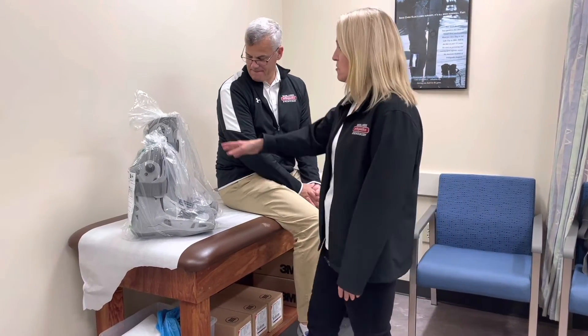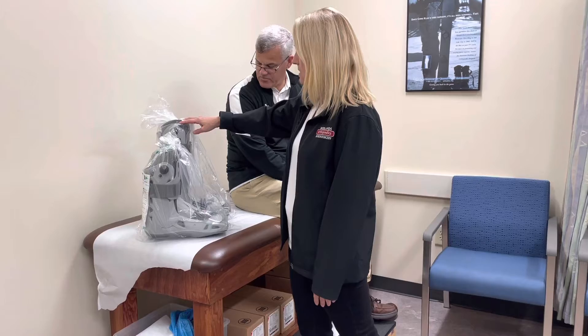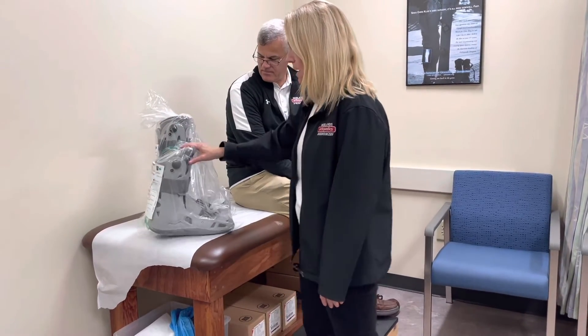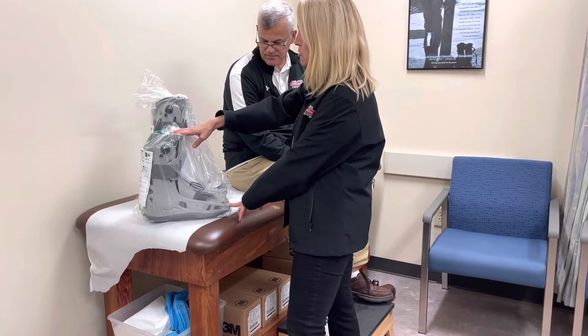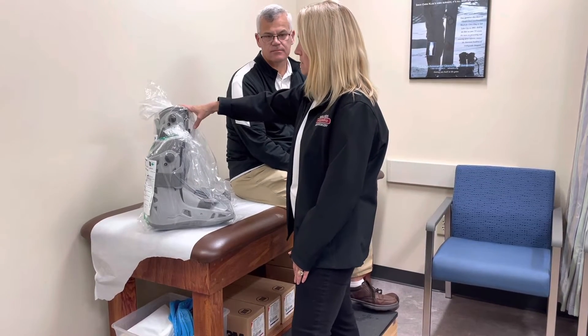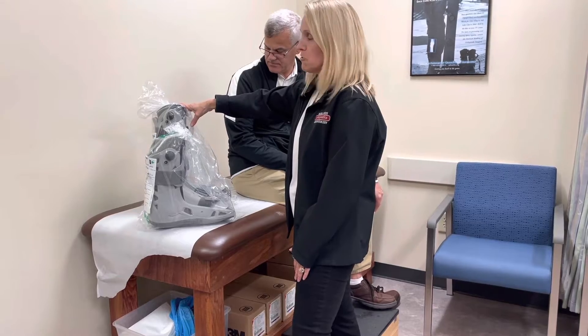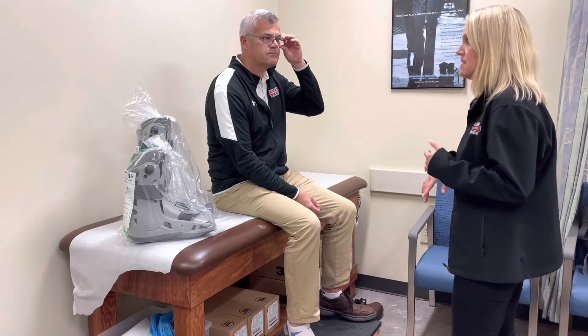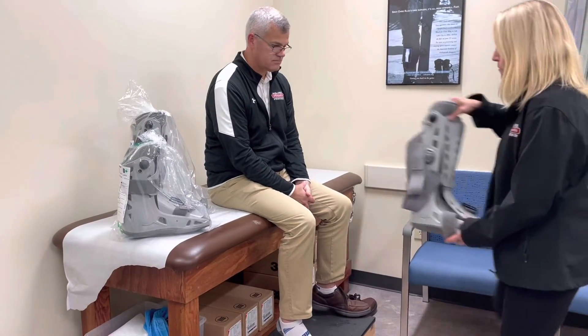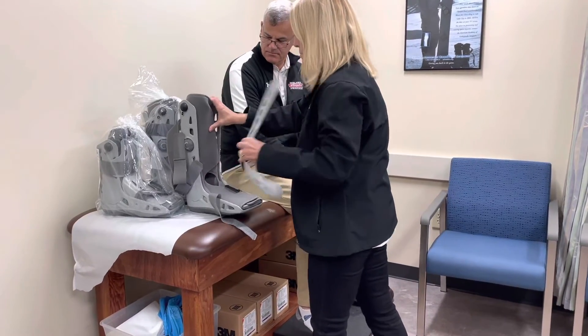The first product we're going to go over today is the air select cam walker. They come in two sizes: a standard size and an ankle size. We typically use the ankle sizes for metatarsal fractures, but ankle sprains, tendinitis, and ankle fractures go in the standard size. They come in extra small through extra large. We're going to fit Ron in an extra large today — he wears a size 13. I size myself in a medium, which is our most common size, fitting patients from a women's 7.5 to a men's 10 or 10.5.